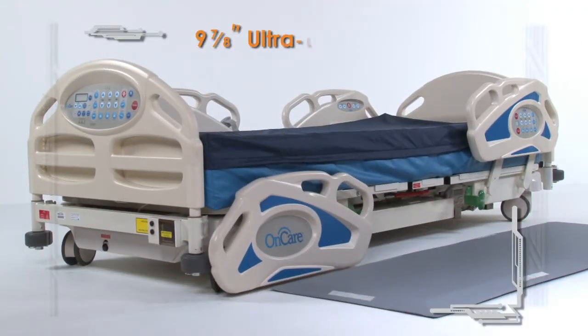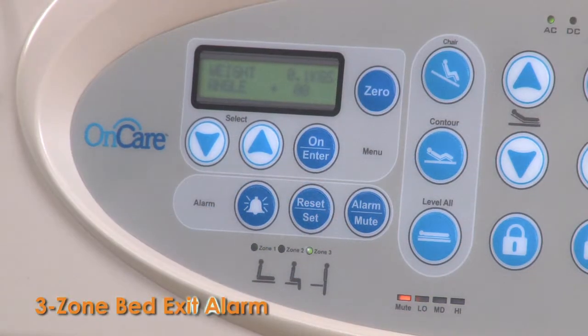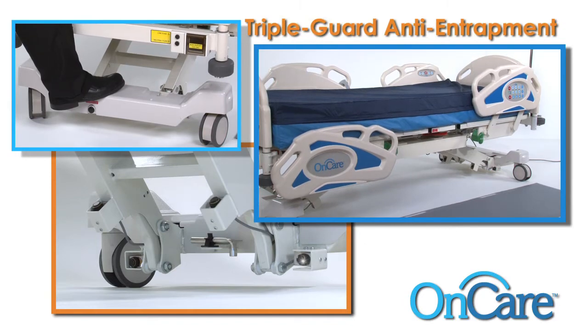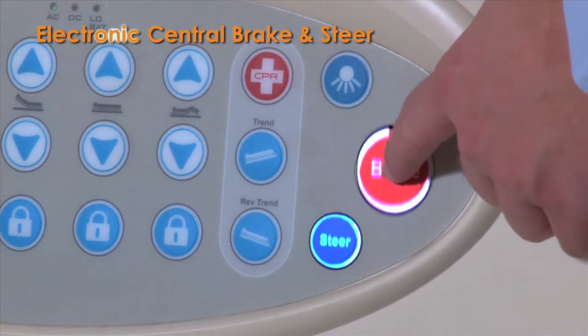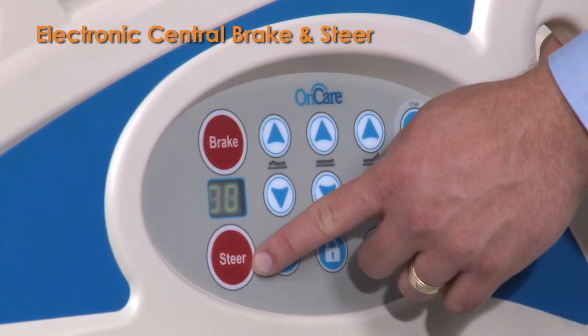The Harmony's ultra-low deck height of under 10 inches helps reduce the risk from falls. A three-zone bed exit alarm and innovative triple-guard anti-entrapment system help minimize patient injuries. The easily accessible electronic central brake and steer controls at the side rails and footboard provide safe patient transport.